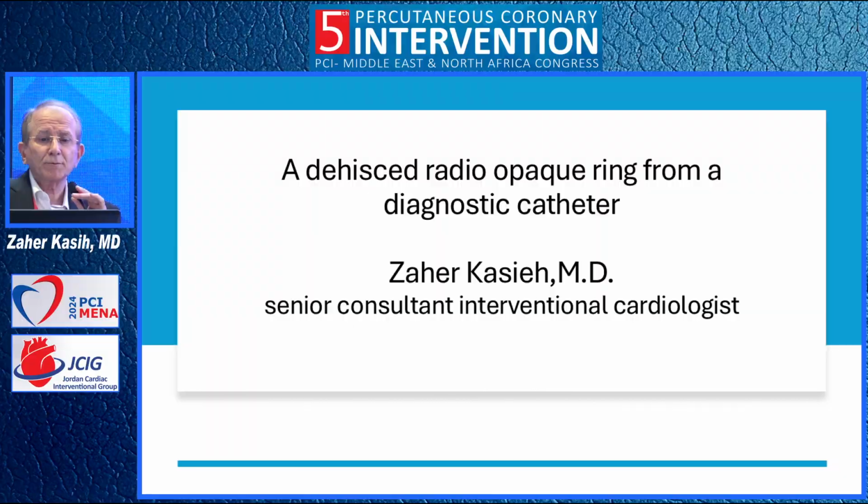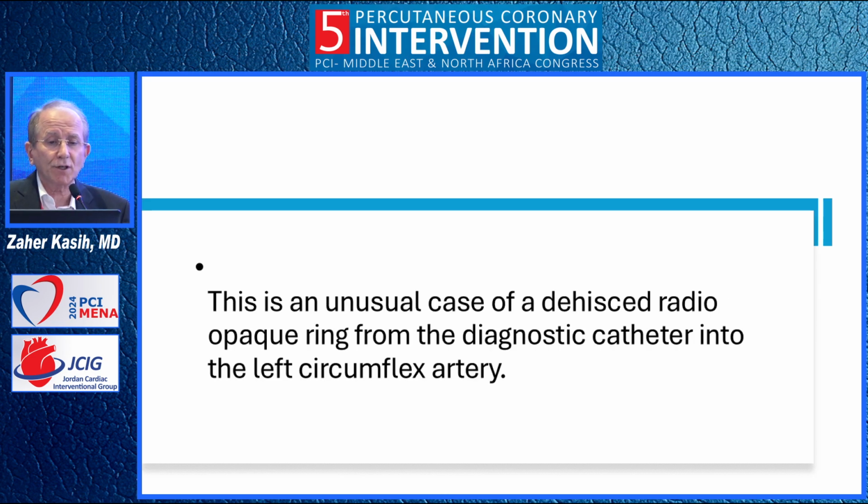Okay, thank you. I'm going to talk about a dehisced radio-opaque ring from a diagnostic catheter that happened during one procedure. This is an unusual case of a dehisced radio-opaque ring from the diagnostic catheter into the circumflex artery. Actually, this is quite a rare complication. I could see only a few cases from India of the same complication.